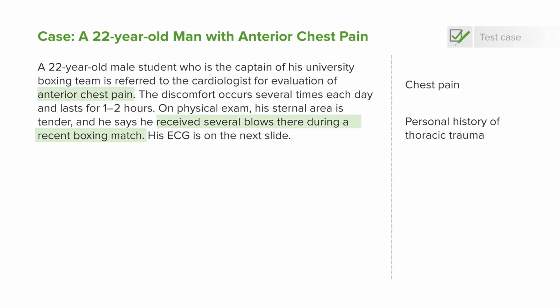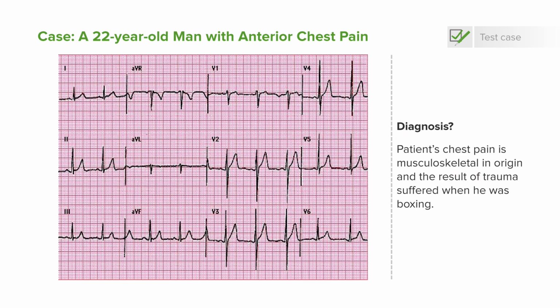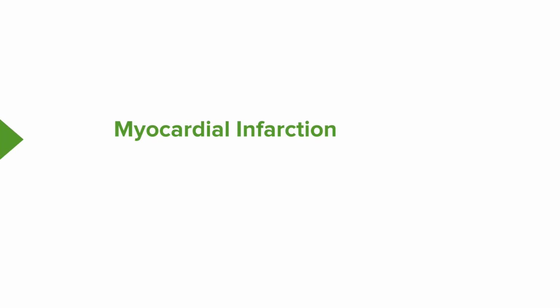We get an ECG done, and by the 9-step examination we can see the rhythm is okay, the rate is almost 70, the axis is okay, positive and positive, and no ST-T changes are there. So this is a normal ECG, and the diagnosis becomes musculoskeletal chest pain. We can give NSAIDs and the patient will be okay.